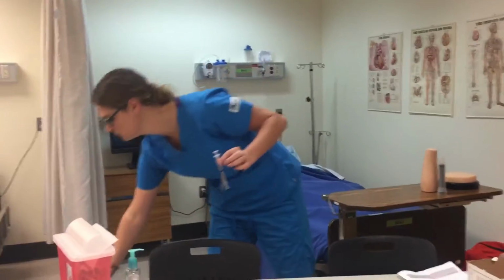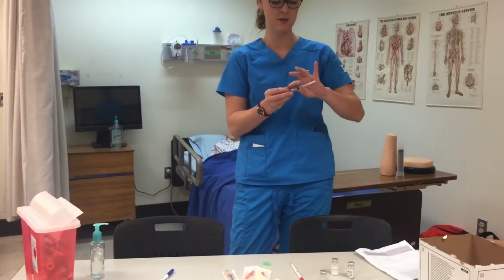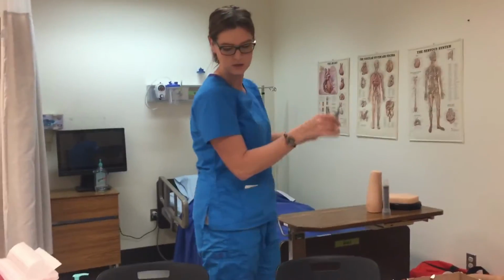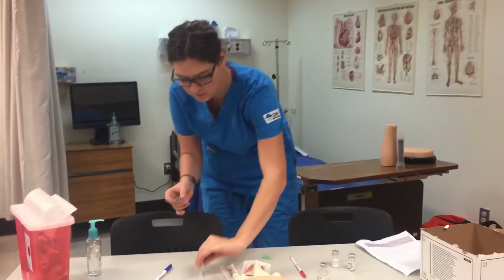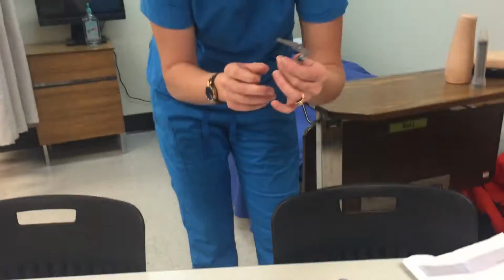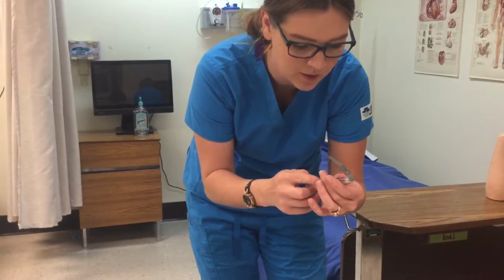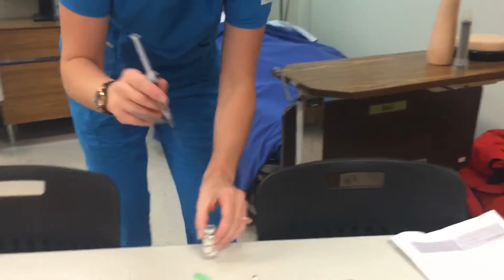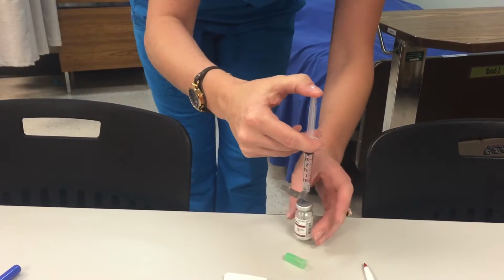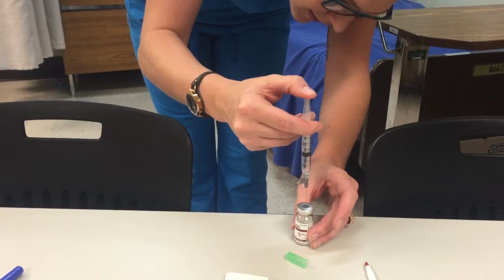Open this. Move the safety out of the way. Whenever I open a cap, if I'm near a patient, I would turn my back to the patient and open like this, away from the patient. Okay, so first I'm going to inject 3 mils of air into the airspace of the liquid to create a vacuum and put some pressure in it. Into the airspace. Then I'm going to turn it upside down and let it fill.